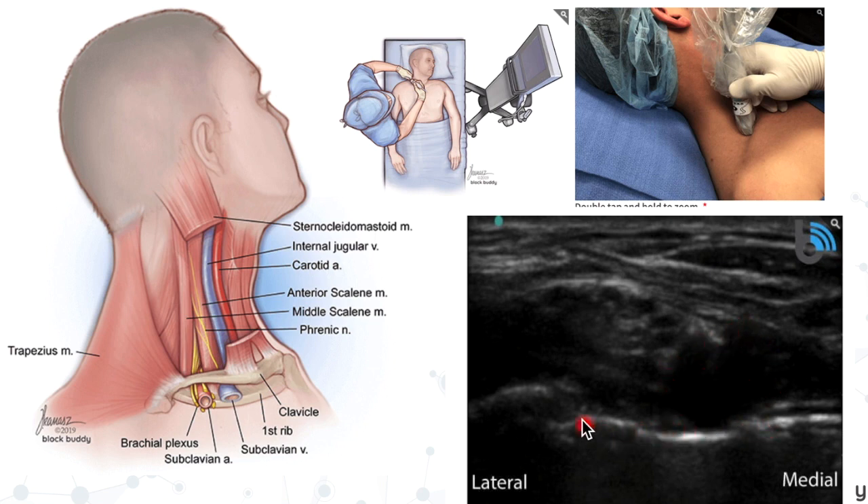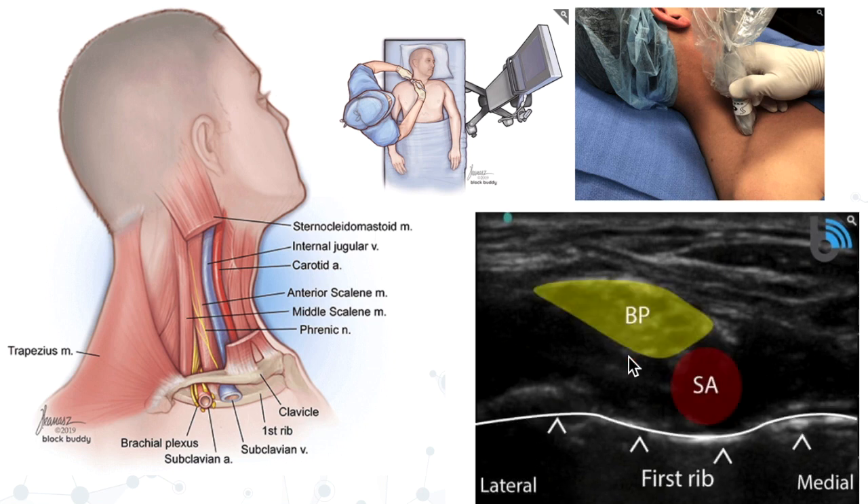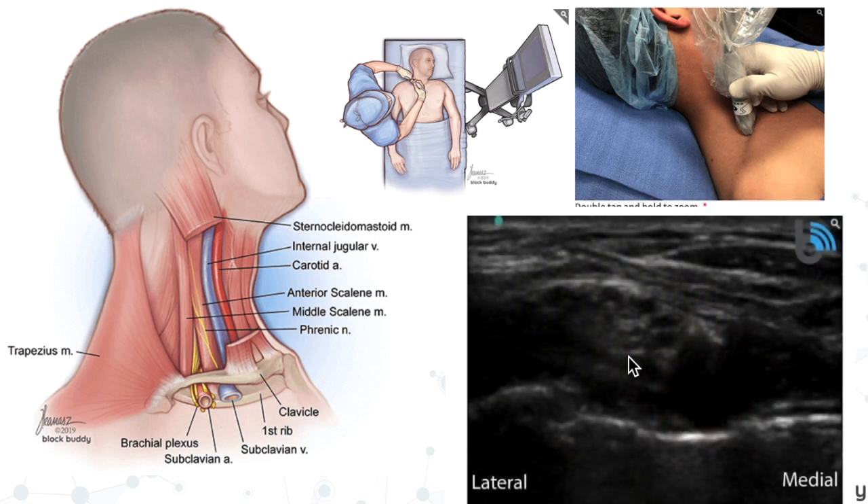You may have to slide the probe medial and lateral a few times while looking at the screen until you locate that pulsating subclavian artery — an anechoic black circle. You're also going to see a very hyperechoic white line underneath it — that is the first rib. The left side of the image is lateral and the right side is medial. Once you see the subclavian artery pulsating, look superior and lateral and you'll see a little bundle of grapes — multiple little anechoic black circles with little white lines between them. This is the brachial plexus.